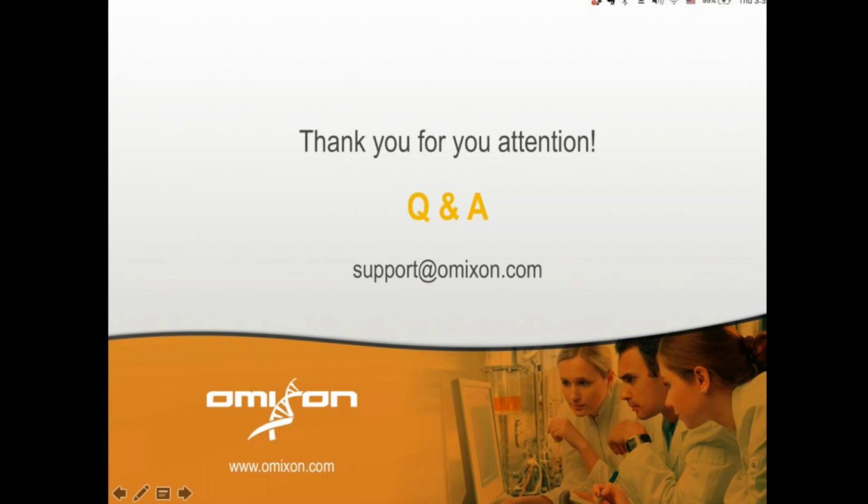Thank you, Libor. There is another one here that is probably relevant. Do I need to purchase additional equipment or reagents to run this ABO NGS kit? I guess the answer varies whether you are a current Holotype HLA user or not. If you are a current Holotype HLA user, then you don't need anything that you don't have in your lab. You already have absolutely everything that you need. If you are not a Holotype HLA user, you need either a plate fluorometer or a qPCR machine, either one, and the sequencer, really. That's all.